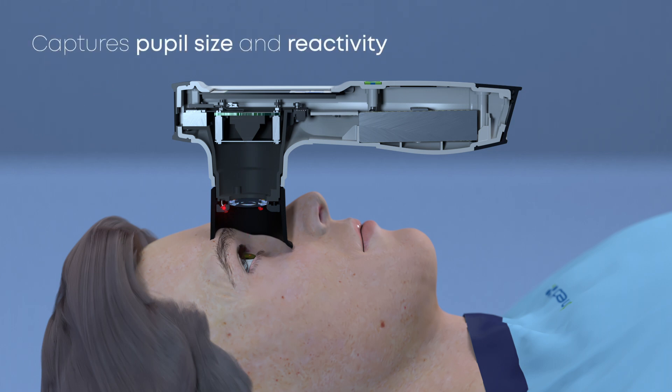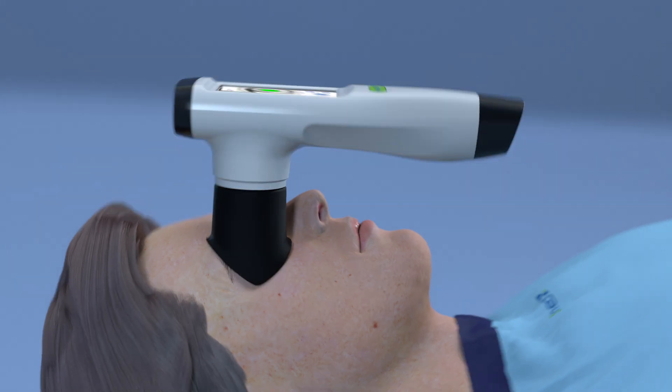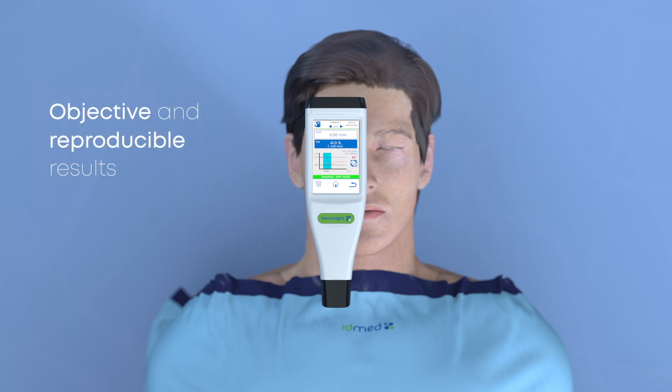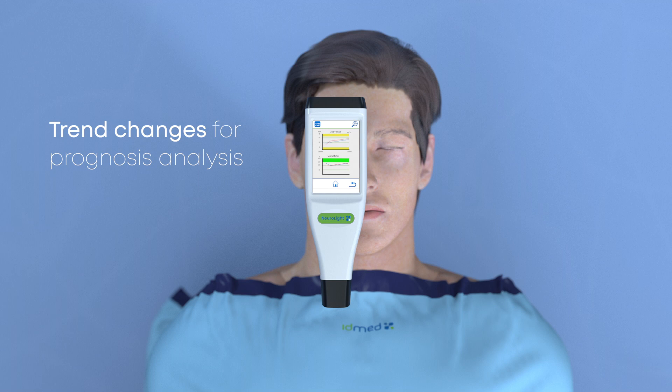NeuroLight captures precise pupil size and reactivity within one-tenth of a millimeter, and it takes just four seconds. You can measure multiple times and the results are reproducible every time. Trend the data for prognosis.